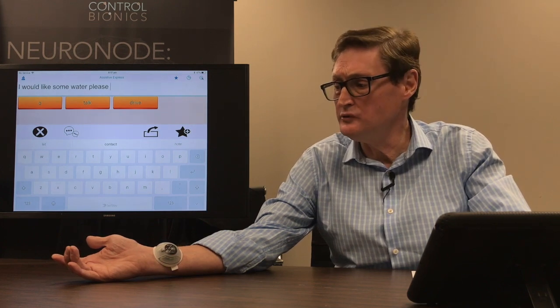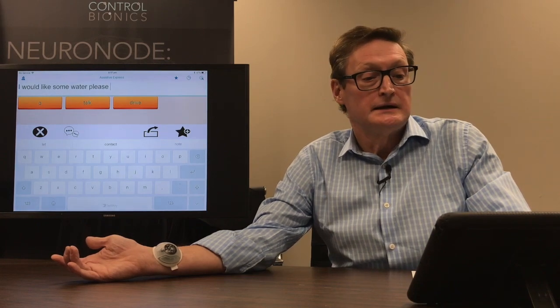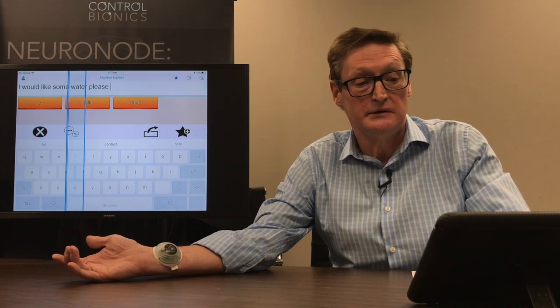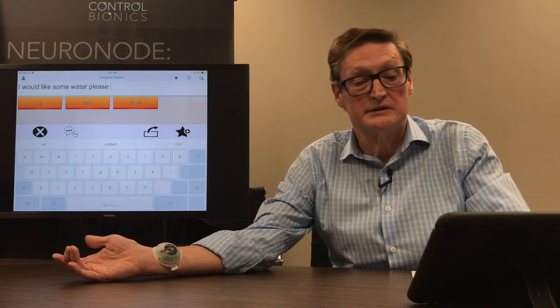Now you will see some movement on my finger, and that's because I am able to move. But I can take that signal now and I can begin to repeat that message. So I can simply initiate, go down to that little speech bubble. I would like some water, please. And be able to say the same thing.